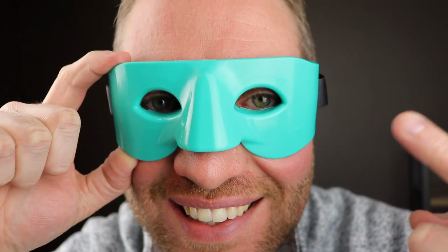Now one additional pro I do want to mention regarding actually keeping your eyes open while you're doing the warm compress is that this allows you to blink while you're doing the warm compress.